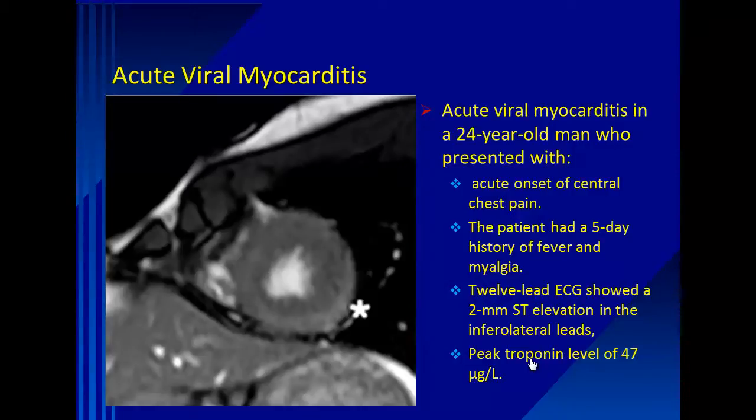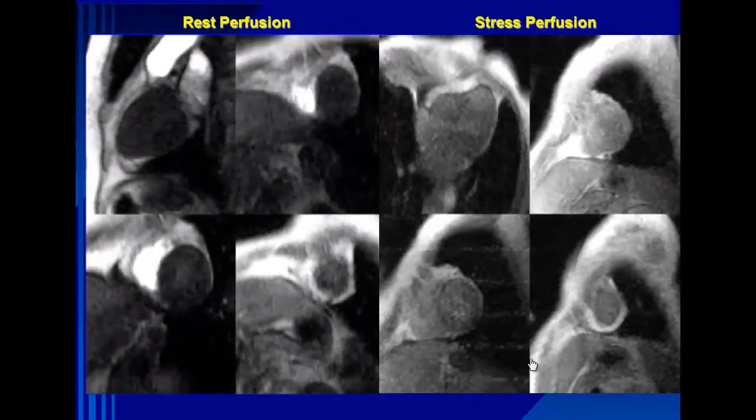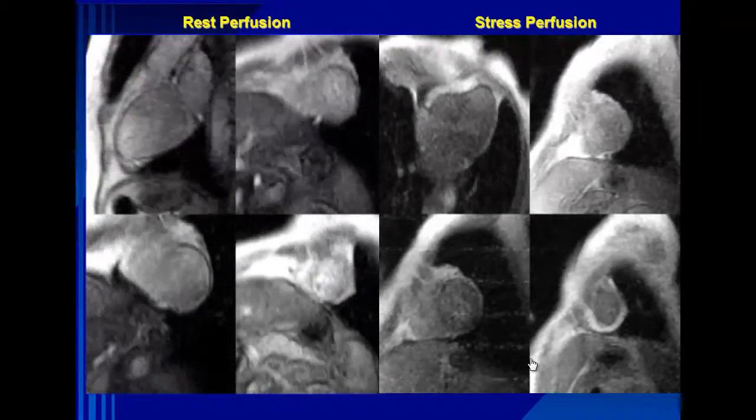Myocarditis, again, MR is an extremely useful tool for myocarditis. And in this image, you could see myocardial edema, which is this darkened area right here. And then, as the course of myocarditis continues, you can see how it becomes dilated and obviously very deformed. So we have the ability almost to sort of date myocarditis, if you will. All right. Now this one works. This is myocardial perfusion.